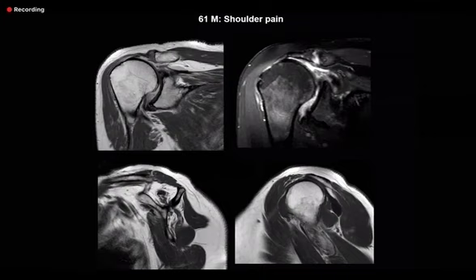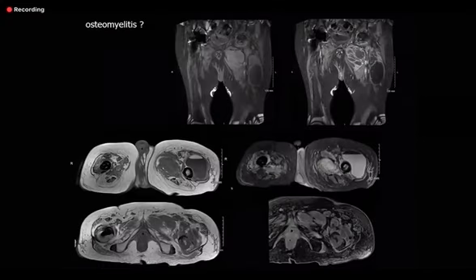Similarly, the second exam case in shoulder is recurrent shoulder dislocation, in which there might be a full thickness tear, might be a partial thickness tear, with that Hill-Sachs lesion, with that Bankart or a bony Bankart. Please remember, for Hill-Sachs lesion, the examiner is going to start with an axial. And the key thing is, as you were told today, that the rounded appearance of the head of the humerus becomes distorted on an axial. So I warn you that they will start with an axial regarding Hill-Sachs.